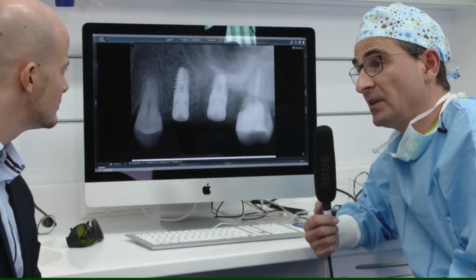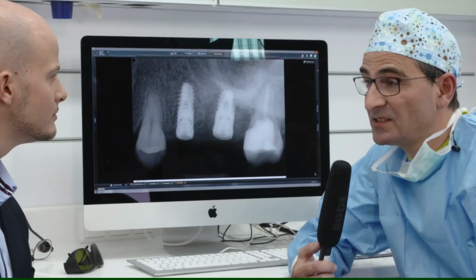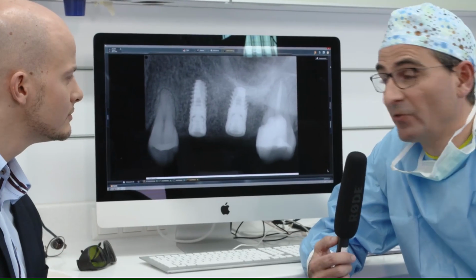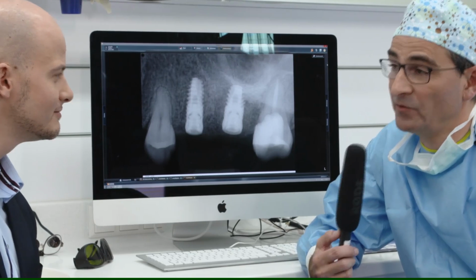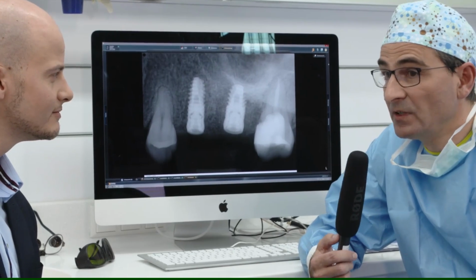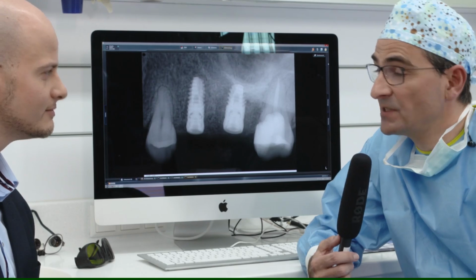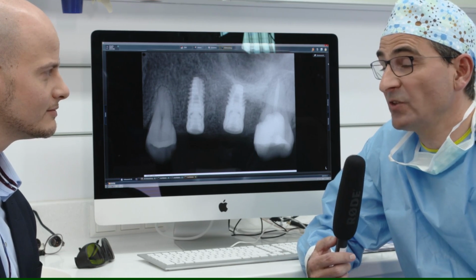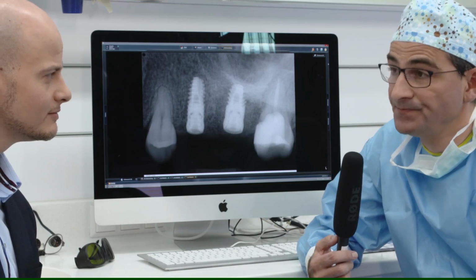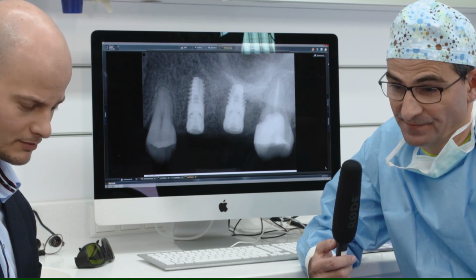We wait another 4 months. It's not so much time. If you see, she's only 34 years old. 3 or 4 months are nothing. And then we go on with a digital workflow. That means we open this and then we make our scan with the CEREC system, with the scan post and all, and then we make a screw-retained crown in this case.